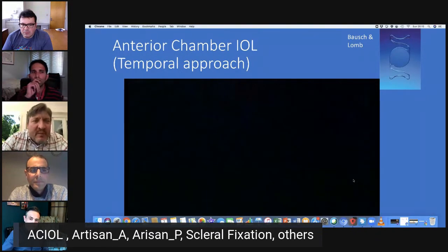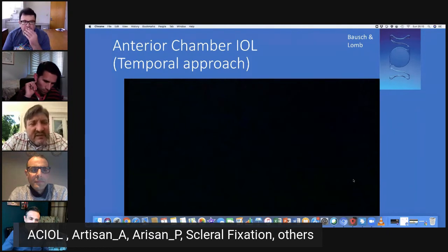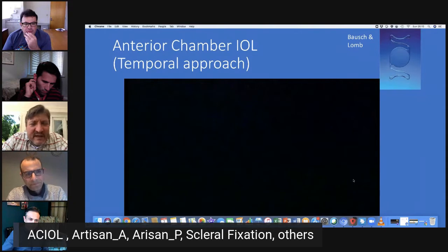So you can make the argument that maybe we should be using the anterior chamber lenses. The older patients also have decreased endothelial cell counts. So I'm pretty facile. I use them when I have to. There's nothing wrong with them. I just really like putting the lens behind the iris.